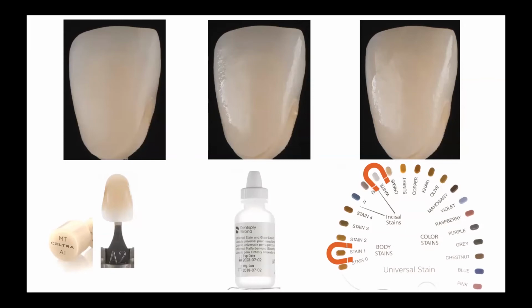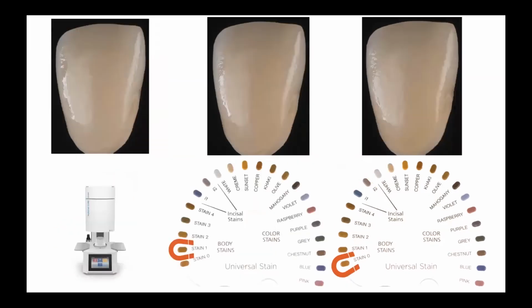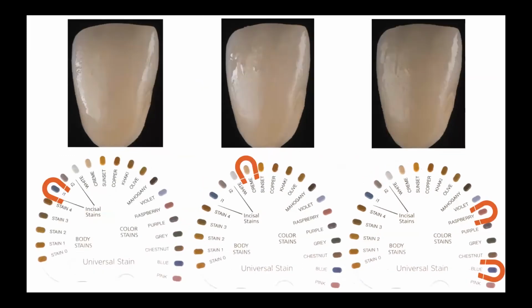And as I said previously, the proper shade stain can be mixed with white color, and this way the opacity of this mixture is increased, and it can work like opaque dentin at the time of layering technique and mask this area. And after the previous firing, we continue our technique with applying of body stain, with applying of orange body stain to emphasize the cervical aspect. After that, we continue to customize our enamel area with regular enamel stain and emphasize mamelon and halo with cream.